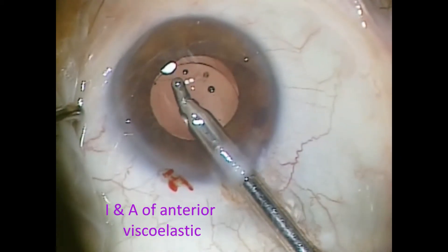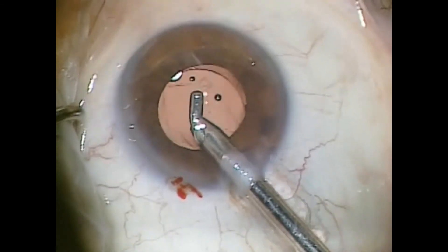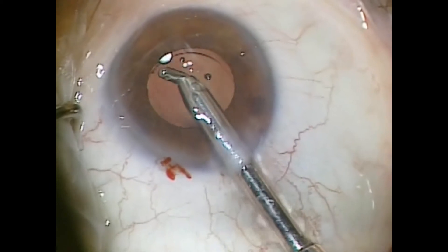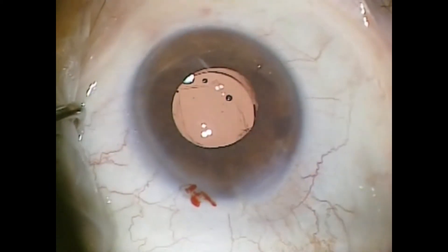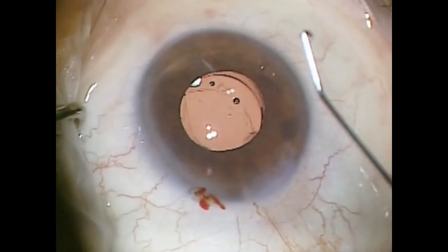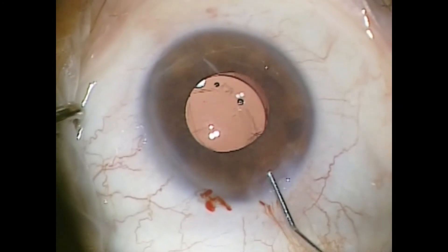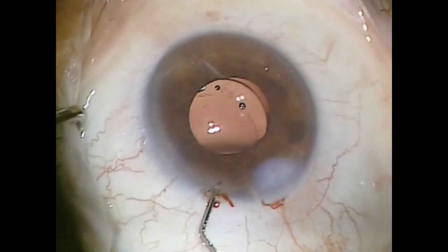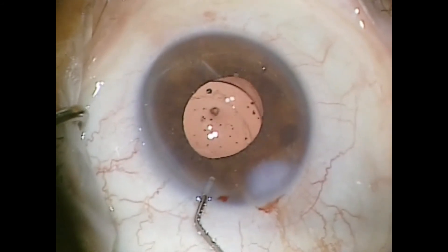In about five or six seconds, as I tap on the lens, I'm just getting the anterior viscoelastic out. I'm not trying to get all the viscoelastic out — I'm not trying to get vitreous to come forward. Then I simply seal the incisions. Since I use Wong incisions, I simply irrigate to fill those, and I'm done.